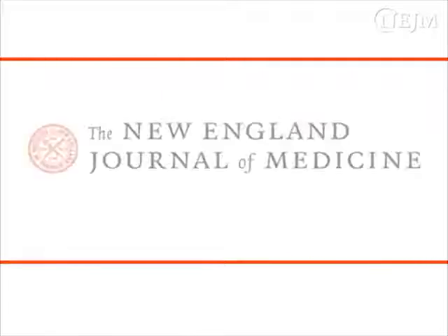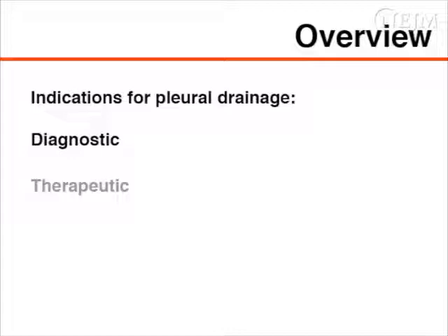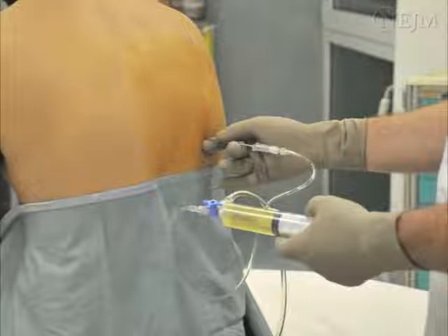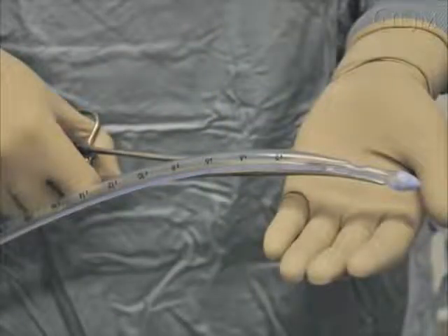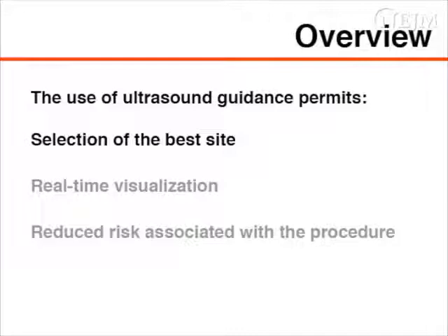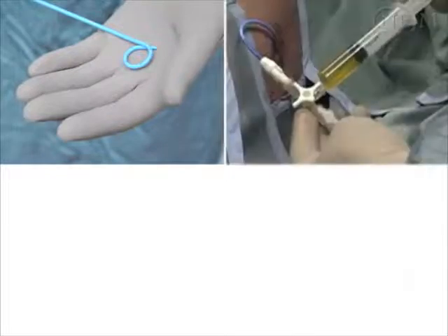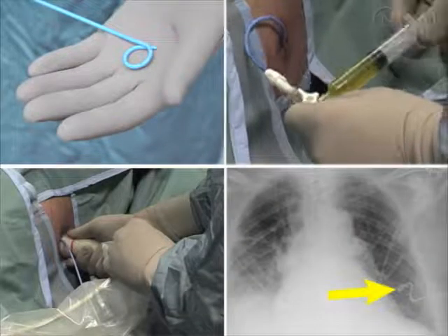This is a video in clinical medicine from the New England Journal of Medicine. Drainage can be performed at the bedside with a single thoracentesis or, for continuous drainage, with the insertion of an intercostal drain. The use of ultrasound guidance permits the selection of the best site for access to the pleural effusion, a step-by-step real-time visualization of the lung structures, the advancing needle, and reduced procedural risk. This video demonstrates ultrasound-guided placement of a small-bore pigtail catheter for drainage of a pleural effusion.